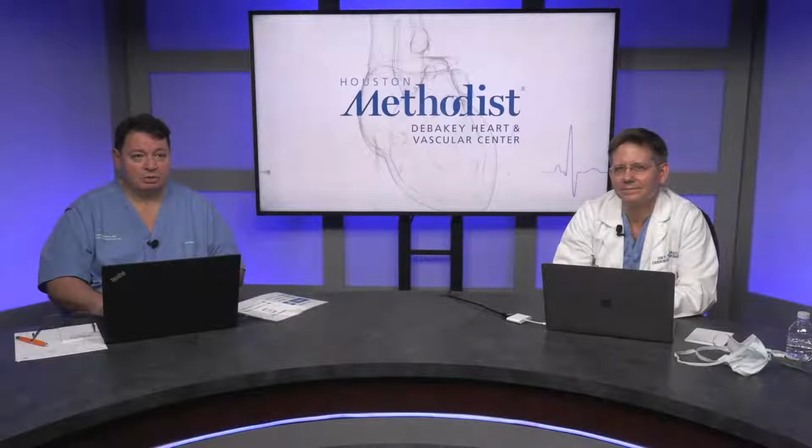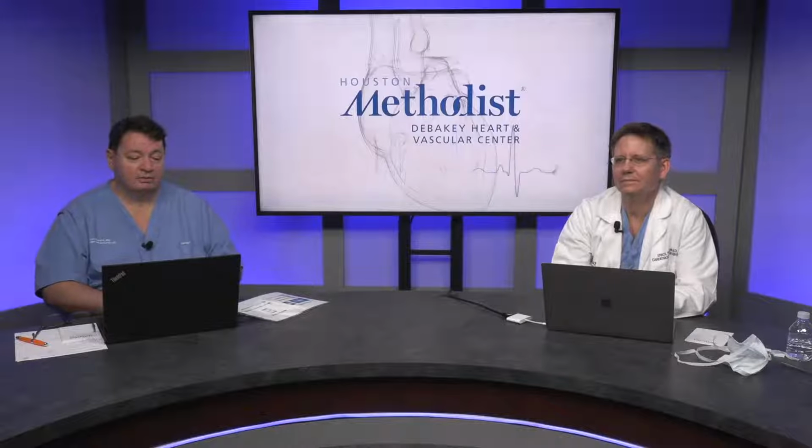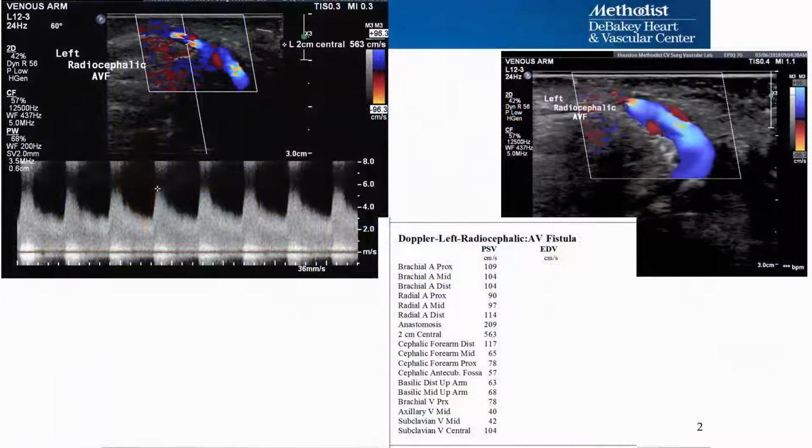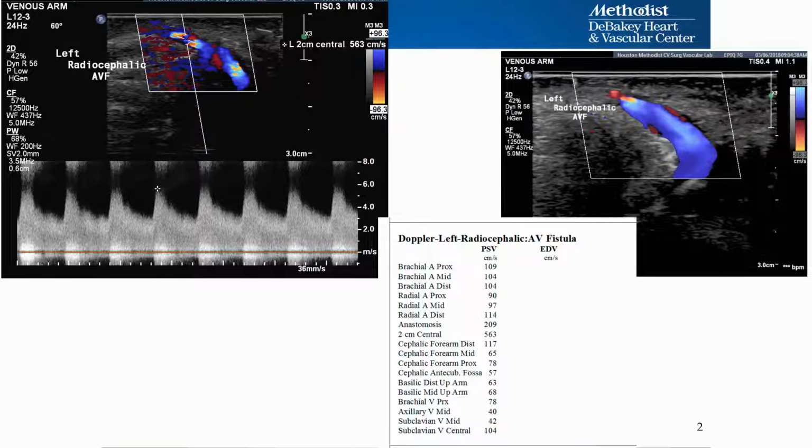And what I would like to do in my introduction is really teach you one of the valuable lessons I learned from Dr. Peden. When Dr. Peden called me and said, double check on this study. This is again an AVF study, and based on the values and the categories we have, the velocity did not triple, but Dr. Peden told me after the anastomosis you expect the velocity to drop, and it didn't drop, and you see the anastomosis here.